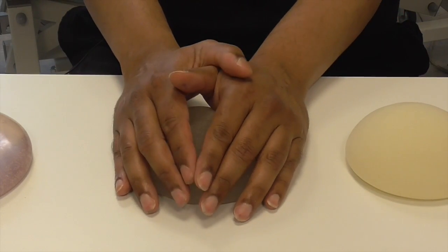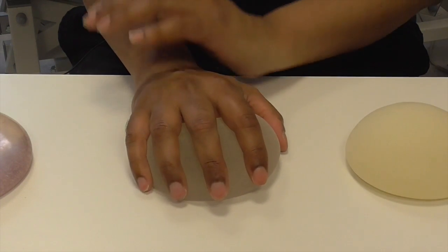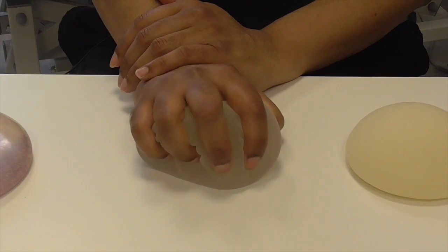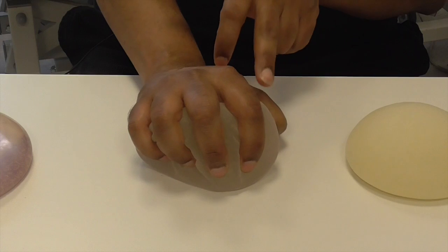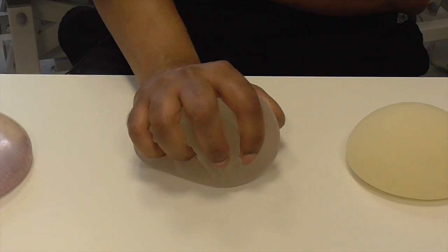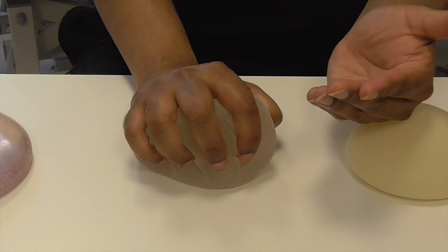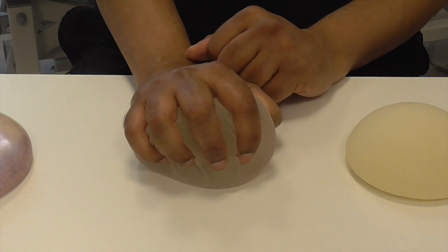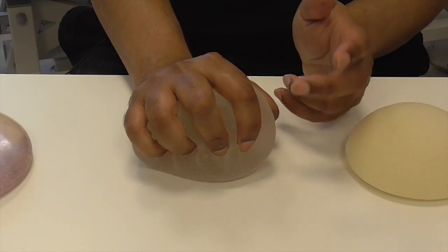But in certain individuals at certain times, you find that the capsule starts to contract much like my hand is doing on the implant. The result is the implant becomes deformed, which can cause the patient a visible or palpable deformity or pain, or in certain extreme instances it can even rupture.